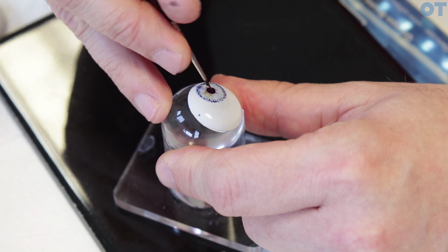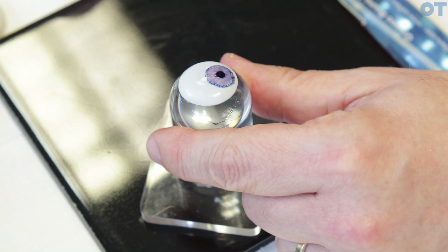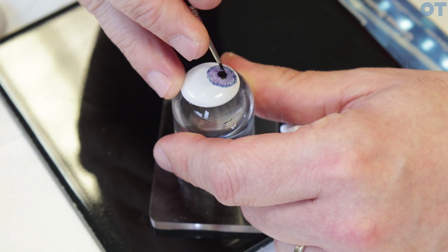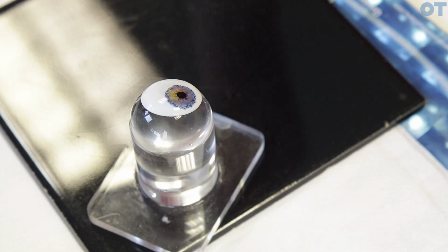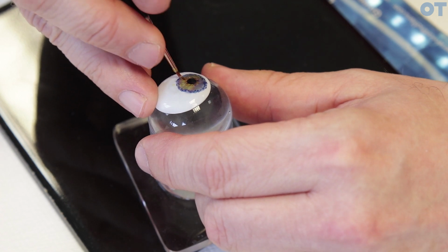And then I'm just shading it here and just creating that illusion of there actually being layers there. You can't hang around for too long, obviously. Paint it as quick as you can because it's drying out as you're painting it. I'll paint the iris first before I do the scleral part of the lens. If anything goes wrong with the iris whilst I'm painting it, there's no point then moving on to the sclera. I have to start again.